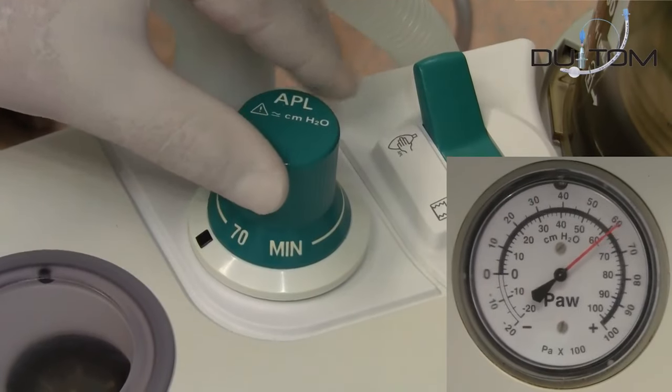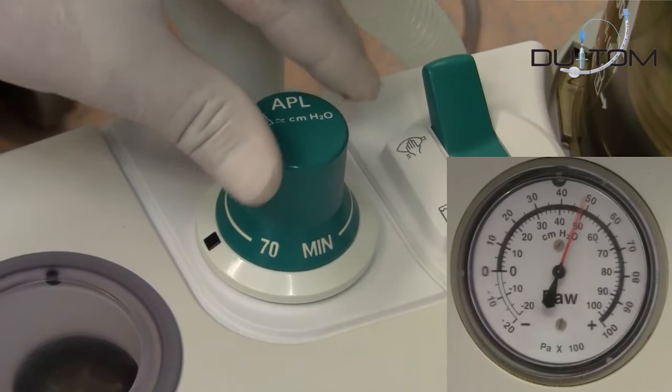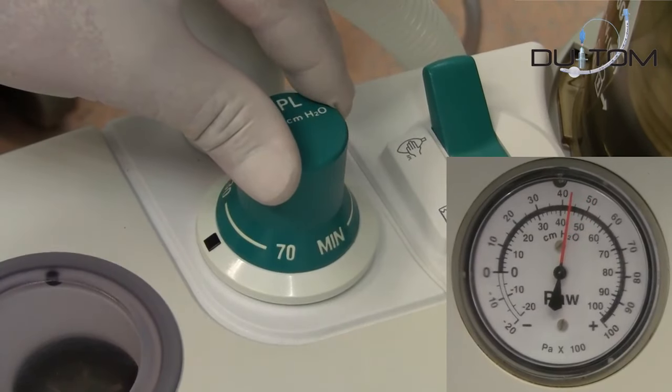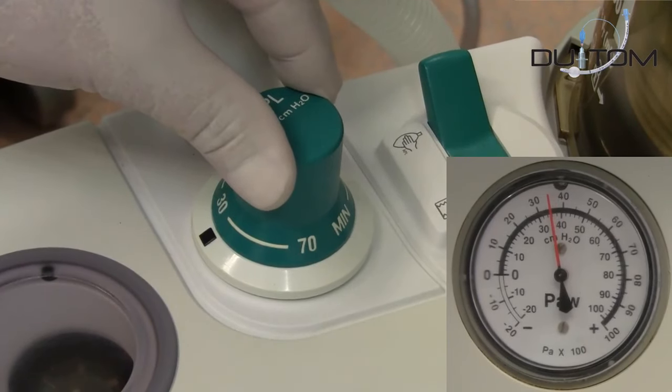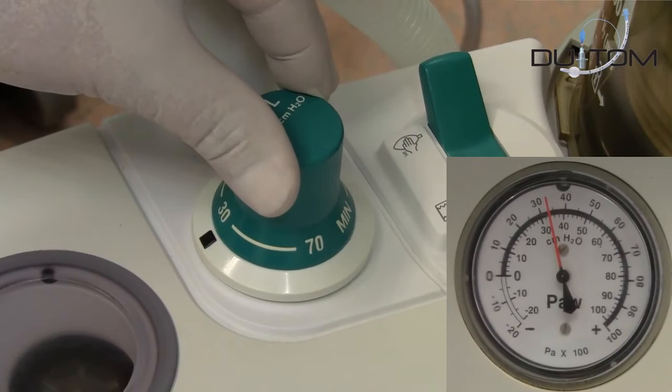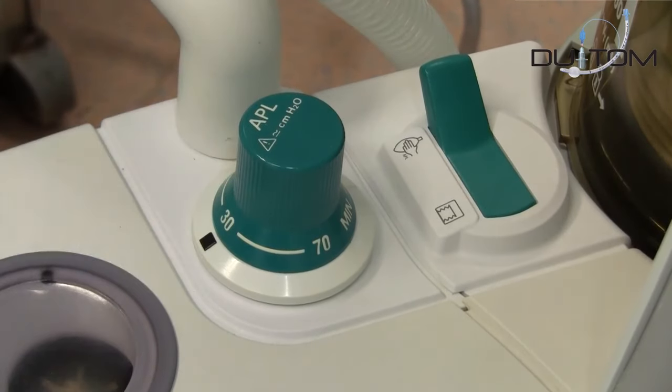Now slowly decrease the pressure from the APL valve until reaching the desired pressure on the cuff. Verify the whole time the registered pressure on the gauge of the anesthetic machine. This pressure will increase or decrease whether you alter the APL pressure valve upwards or downwards.